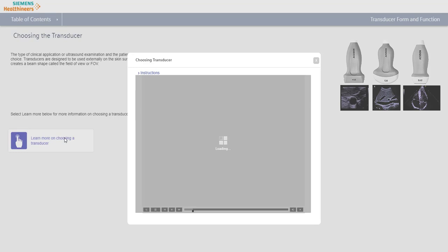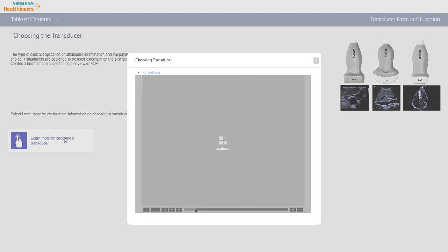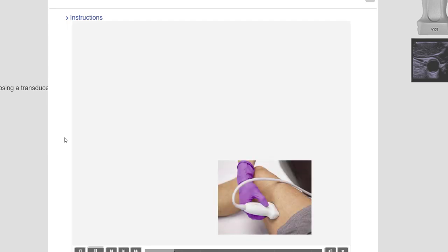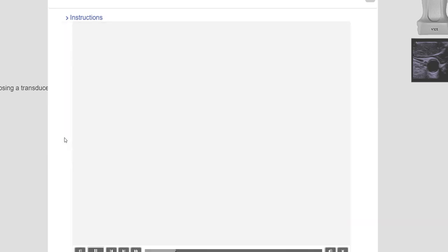In ultrasound examinations of the breast, a high-frequency linear transducer is an appropriate choice to show the detail and tissue composition. Other common applications for the linear transducer are peripheral vascular, as in this vascular exam of the lower extremity. Other common applications are testicular, small parts, and point-of-care applications.